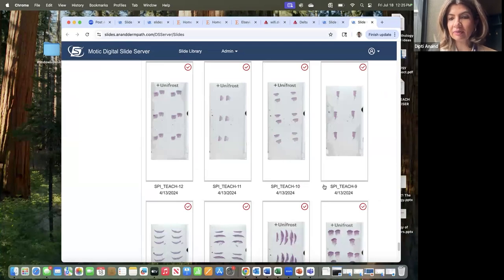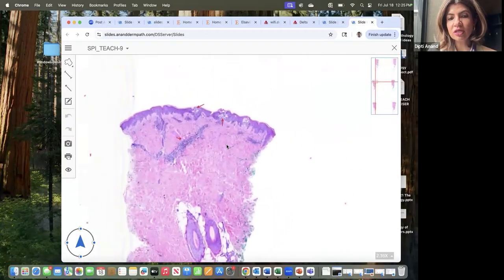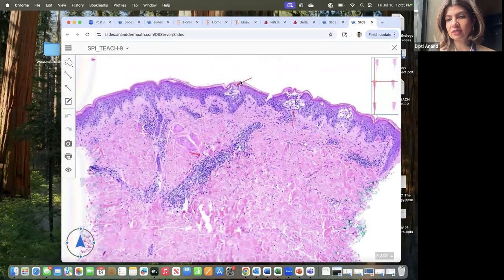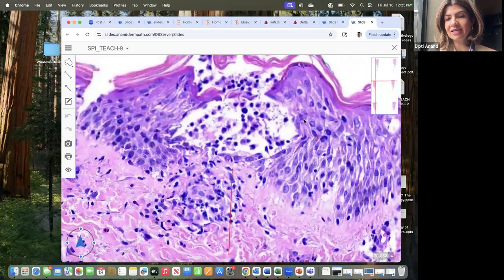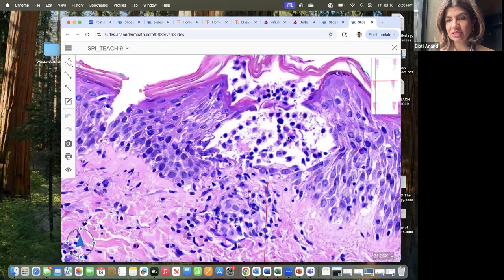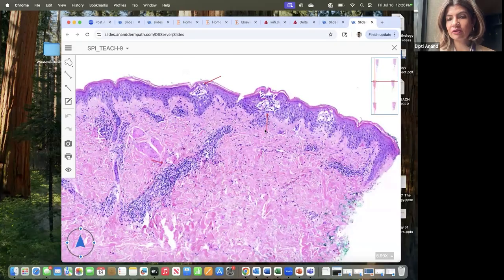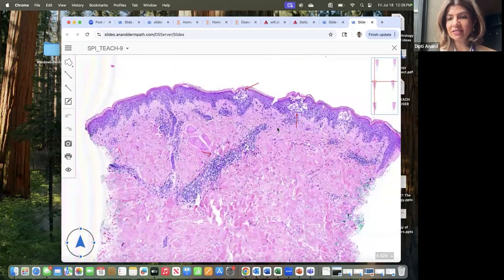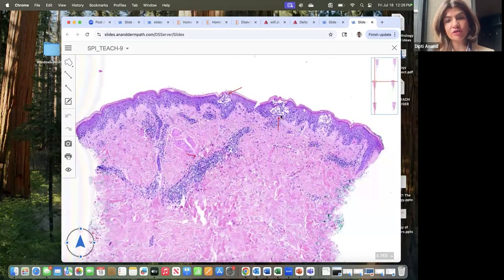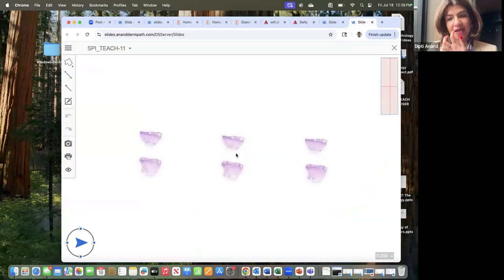The next thing that they can specifically ask you is allergic contact dermatitis. So allergic contact dermatitis looks like a spongiotic dermatitis. So you can see the microvesicles. But when you see these spongiotic microvesicles, which have these Langerhans cells, as you see in here, these are the antigen-presenting cells. They have lots of pink cytoplasm. Then you would think about a primary spongiotic dermatitis consistent with contact. You can even see the dermal eosinophils in the biopsy here. So they can ask you primary eczema, and they can ask you specifically contact, which you will recognize from the spongiotic microvesicles.